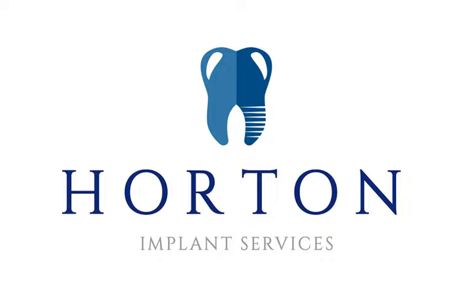So they might want, let's say, a 4 diameter implant, they might order a 3.5, and they might order a 4.5 implant diameter around that, and they might order 8 millimeters and 10 millimeters. So they've got a few implants around the area, just because although they've planned to use that particular size implant, they might alter it. Things need to be provided. So stents, guides, fully guided if you're going down that road. So there's things that need to be ordered and checked that they are in stock and ready for that patient.